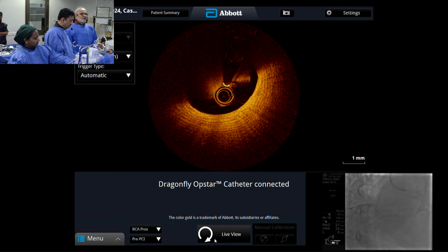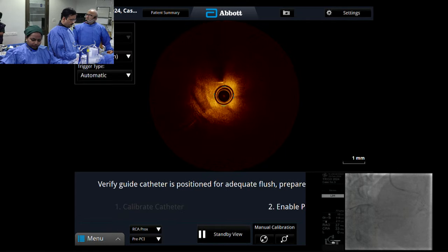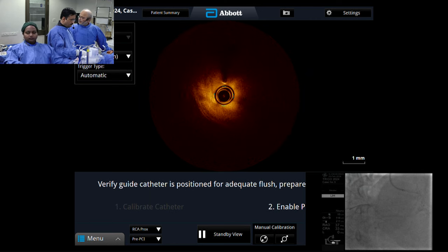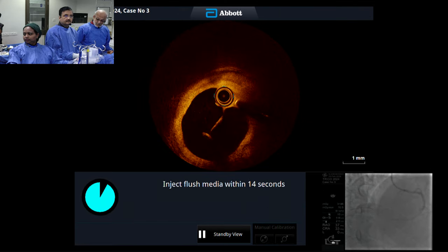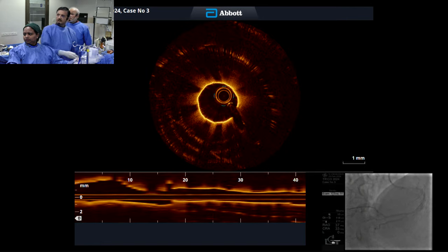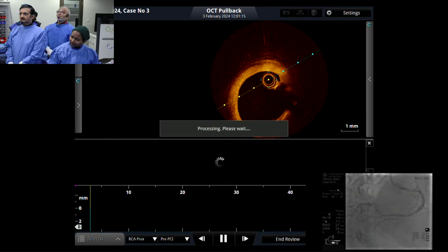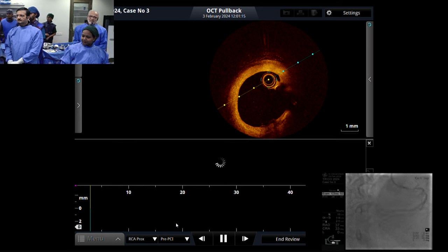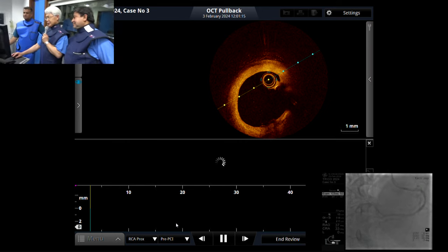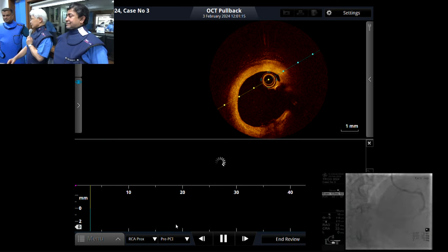Okay? Yeah. Quick injection. Ready? Ready. His delayed injection he is giving. As Dr. Patel said, this is a nodular calcium, right? But no unstable findings. Yes. See, Samir, this is an advantage mainly of presuming the OCT finding on the basis of the angiographic picture. If you go on doing this, most of the times you are right.